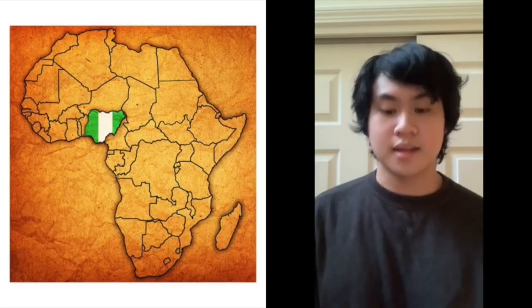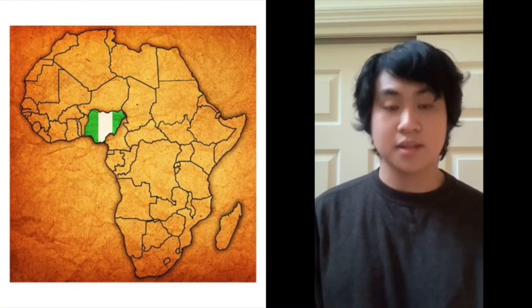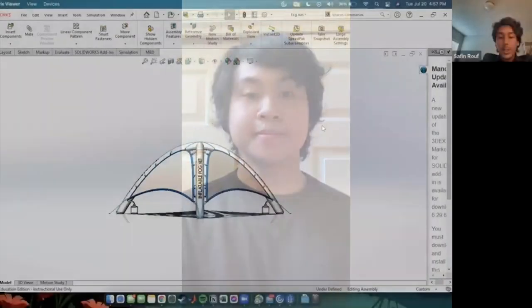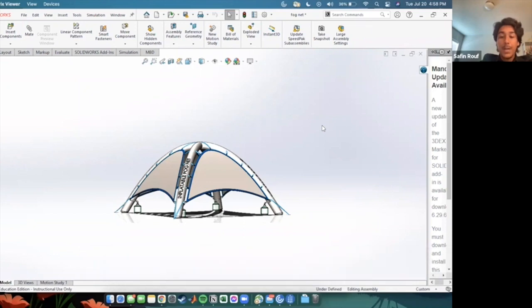These findings led us to conclude that filtered sunlight phototherapy provides an effective and affordable alternative to conventional phototherapy units, and it has the potential to reach underserved communities in rural sub-Saharan African countries, accommodating the large population of babies born outside of hospitals. This structure will be shaped similar to pop-up tents you would commonly see at events. The shape is ideal for withstanding harsh winds, ensuring stability of the device.